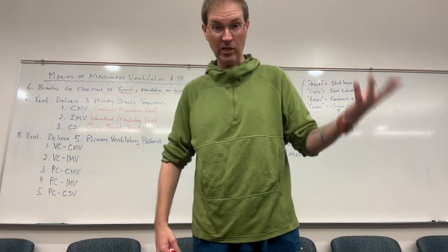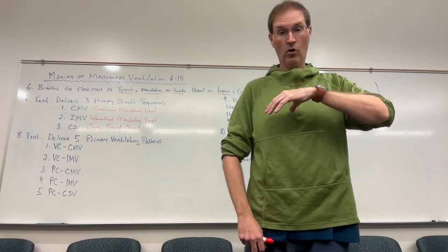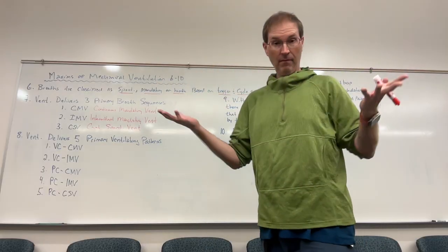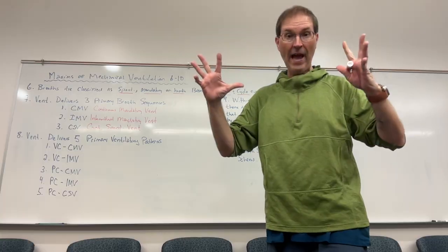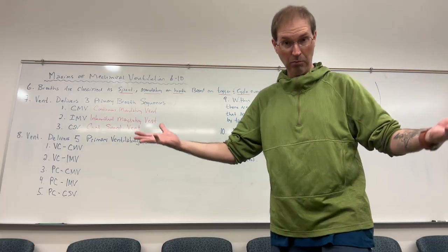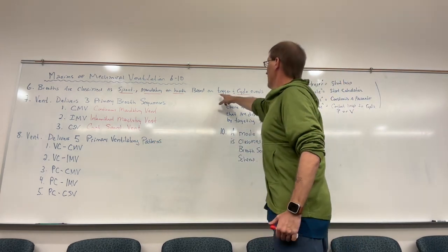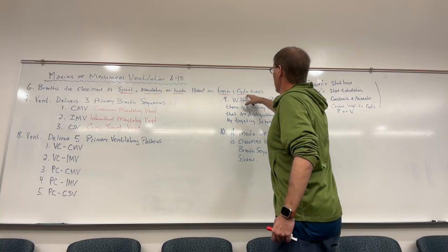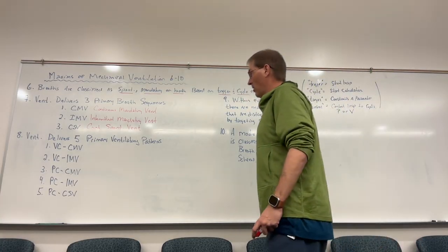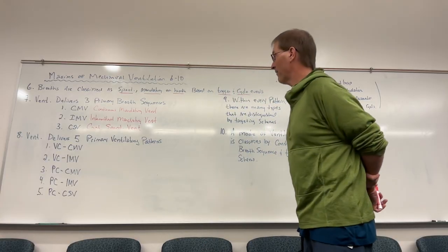Be that maybe in just the form of PEEP or pressure support or an inspiratory and expiratory pressure, bilevel or BiPAP. That doesn't matter. That just means that it is a supported breath. But the fact that the patient is choosing the trigger and cycle events, not the ventilator, that makes it a continuous spontaneous ventilatory breath sequence.